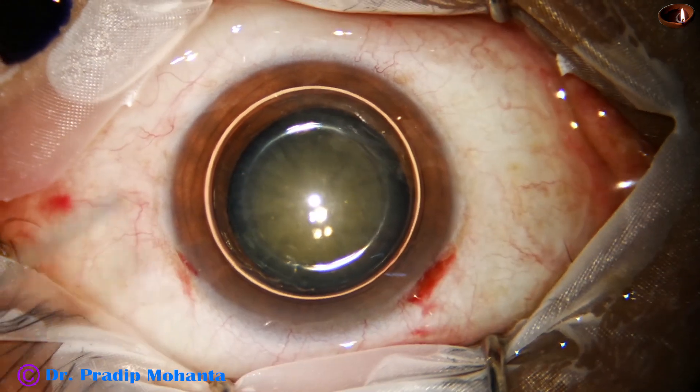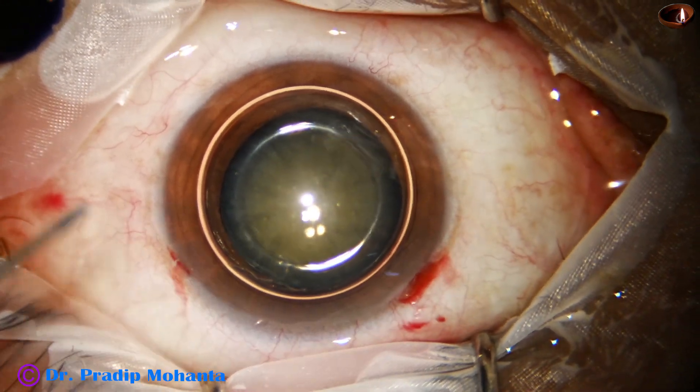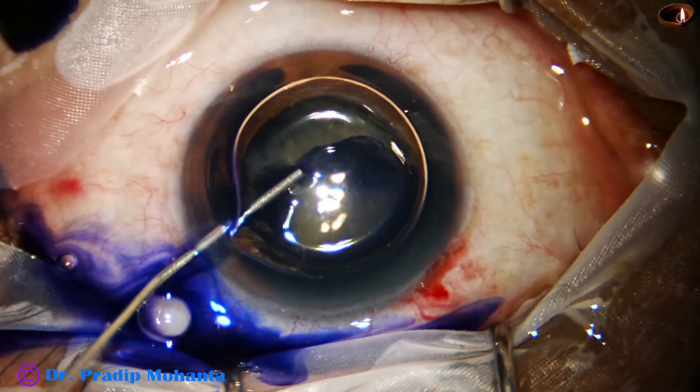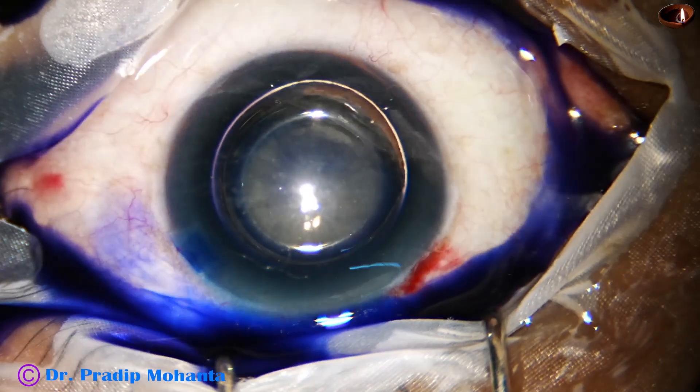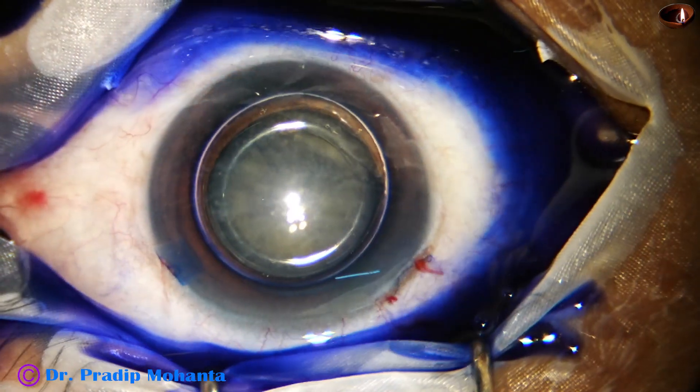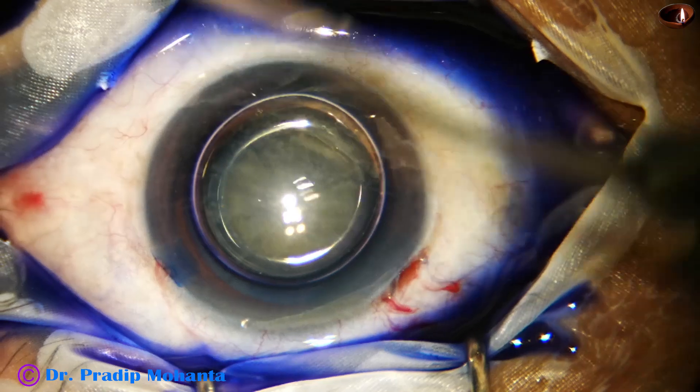So if the side port is a little larger, it doesn't matter too much, but it does matter because a lot of fluid leakage occurs, and in a beginner's hand, chamber maintenance may be a bit difficult.